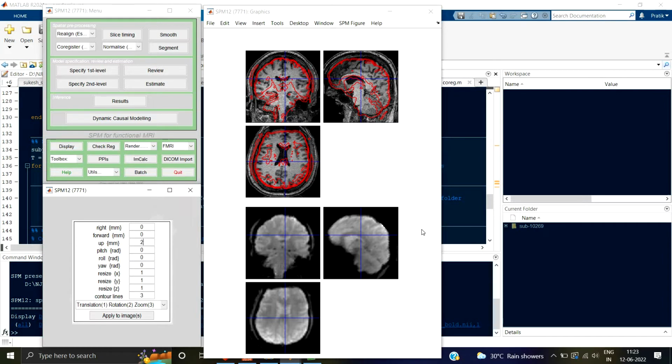So let's take 2. I'm shifting this image up by 2 millimeters. This is okay, but you can do still better. So let me try 4. You can see now it is a little bit better, but I guess I should make it a little more, say 5. I guess 5 is okay. Yeah, 5 seems fine to me. Let me see what happens with 6. Okay, 6 is a bit too much. You can see there is some skull over here. So let me keep it back at 5. Yeah, I guess this is perfect.